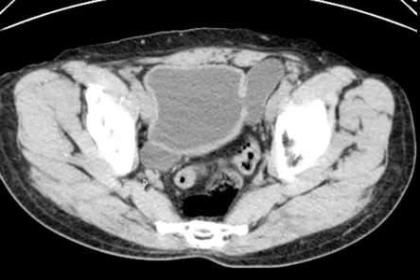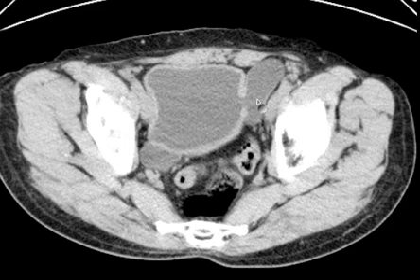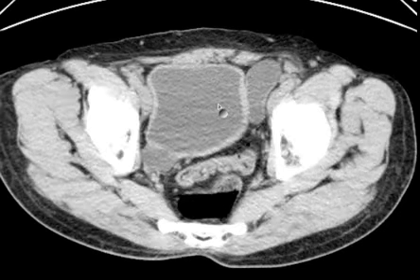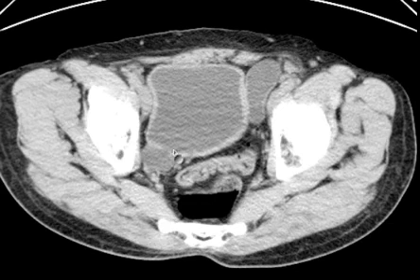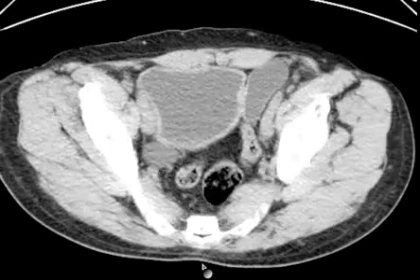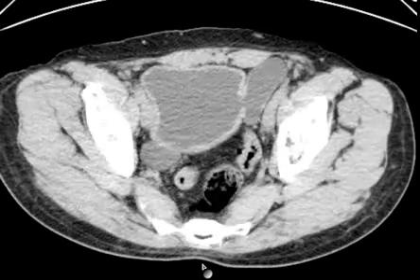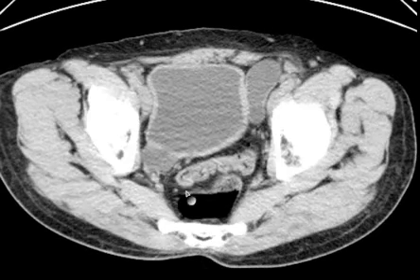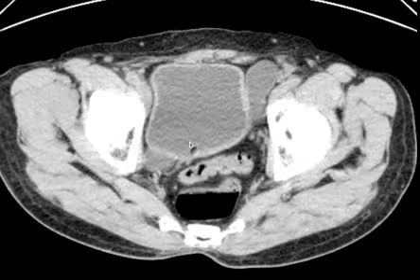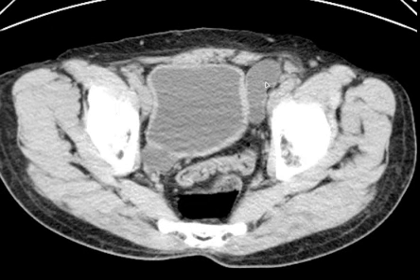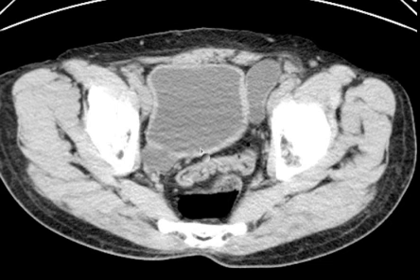Bladder diverticula. You can see beautifully the communication of this large diverticulum with the bladder, and even a little bit of communication here — that's obscured by some volume averaging, but I think there is a communication right here. The patient might have had some cystitis; this looks a little bit thickened.